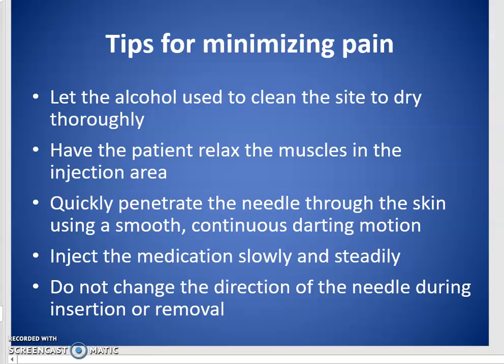Quick penetration with the needle through the skin, smooth, continuous darting motion. I highly recommend that. Inject medication slowly and steadily. I highly recommend that. And never change the direction of the needle during insertion or removal. It should go straight in and come straight back out without any exceptions.